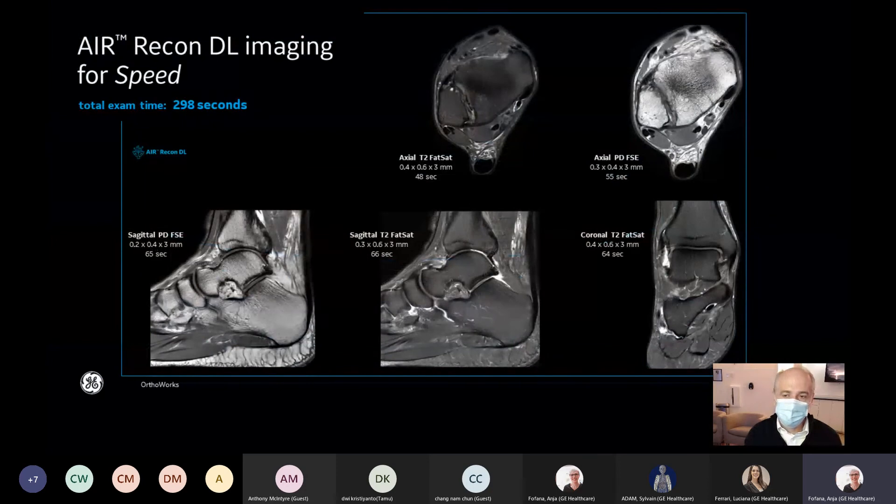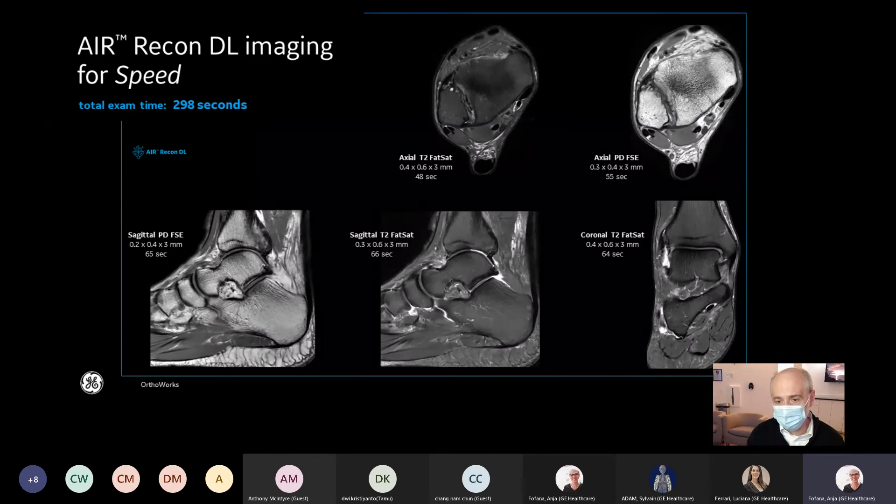Here's a great example of how you could use Air Recon DL for speed. Each of these scans are around a minute or so apiece. This gives you a lot of time to image the patient without worrying about noise. We're keeping the resolution very high while still taking advantage of Air Recon DL to achieve a very short acquisition duration.